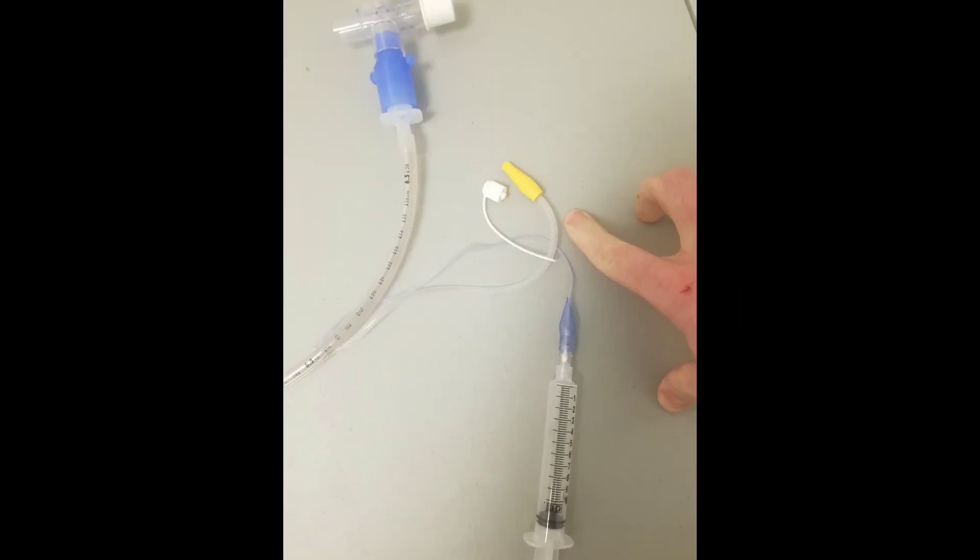Hey everyone, I just wanted to make a quick video about a technique that I use when I have to deflate the endotracheal tube. I don't know if I thought of it myself or other people have figured it out, but I know it's not something that students coming to do their rotations have heard about or that teachers have spoken about.